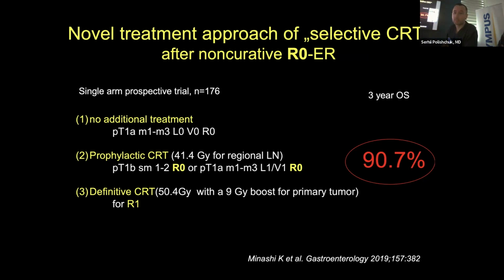Now, there is damage of the mucosa of the esophagus and he is a non-symptomatic patient. No heartburn, no pain, but we see a lot of damage on the mucosa. So yeah, I think the symptoms of the patient are almost the most important. If you have ulcerations and no symptoms, don't touch anything surgically. I think you should follow up the patient so that he doesn't develop cancer or anything like this, but then I would be very careful with an aggressive surgical treatment. Thank you very much.